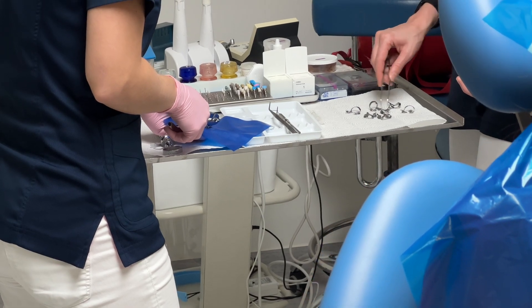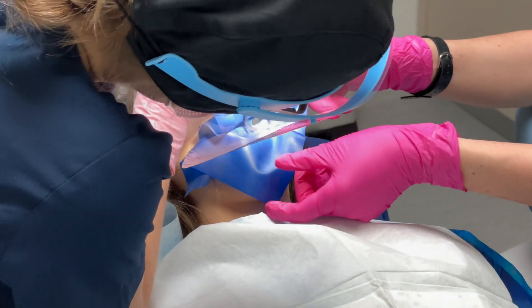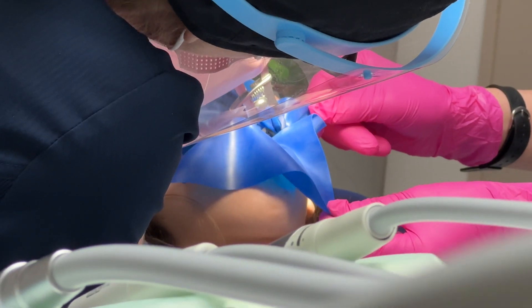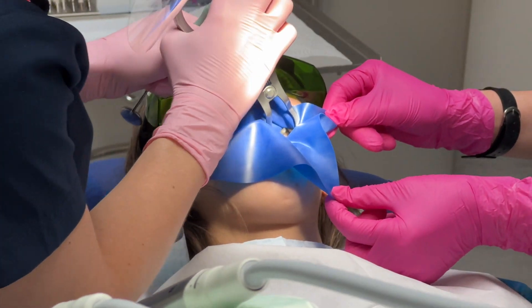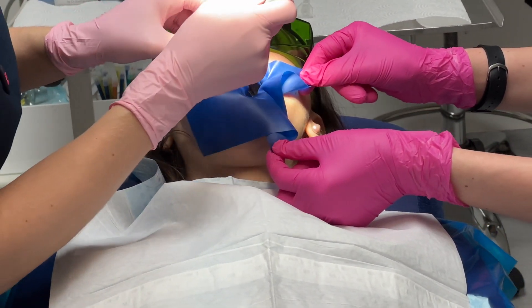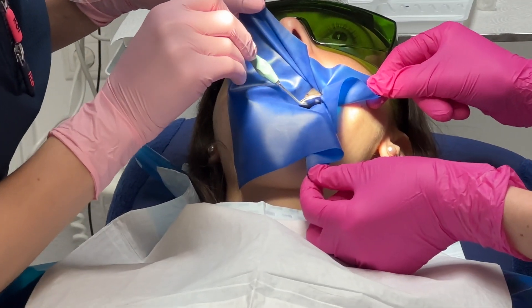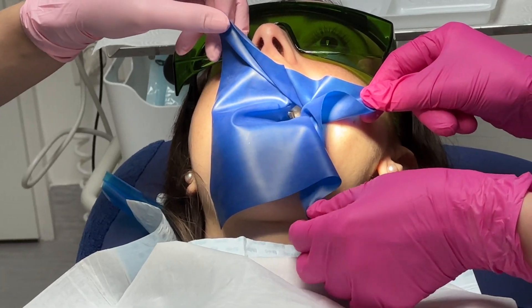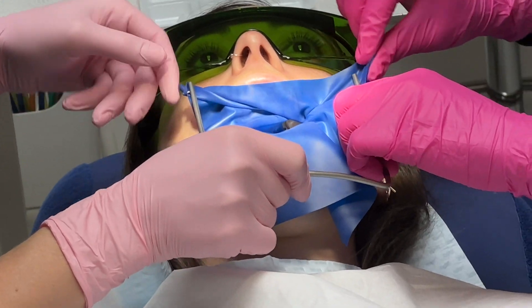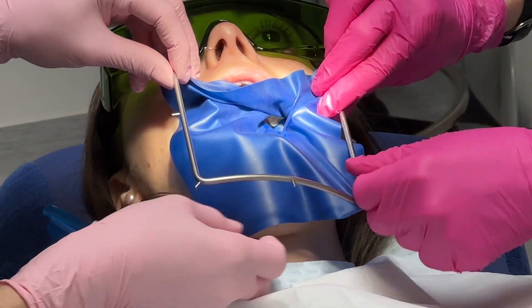A dental dam, or rubber dam, is a thin 6-inch square sheet, usually latex or nitrile, used in dentistry to isolate the operative site of one or more teeth from the rest of the mouth, sometimes termed Kofferdamm. It was designed in the United States in 1864 by Sanford Christy Barnum.